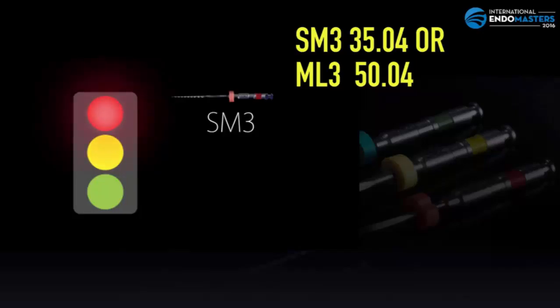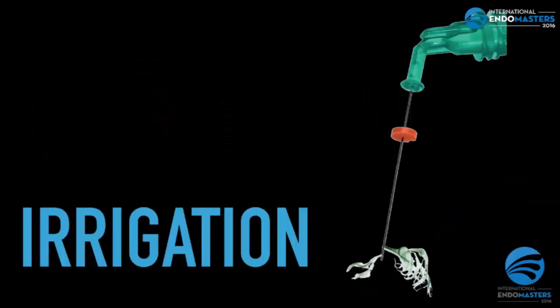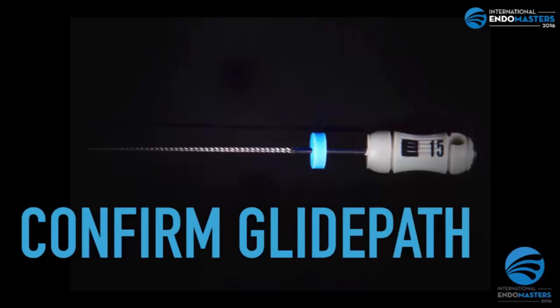I'm going to show you some clinical cases. Always you need to finish your root canal treatment irrigating with sodium hypochlorite and EDTA at 17%. I really recommend that. Don't forget to confirm the glide path.